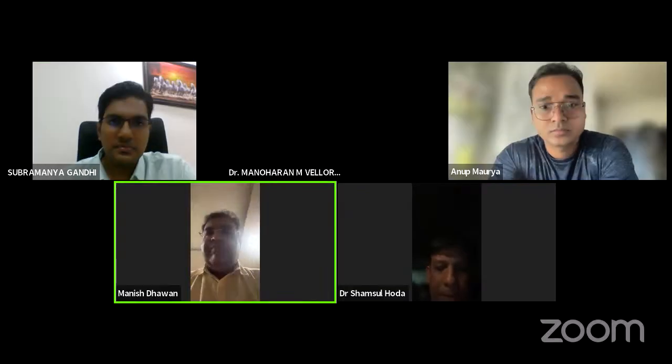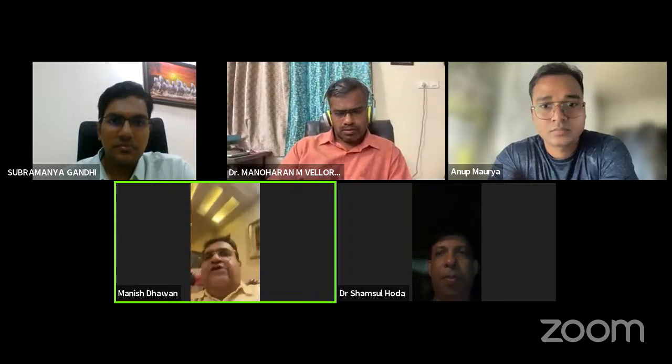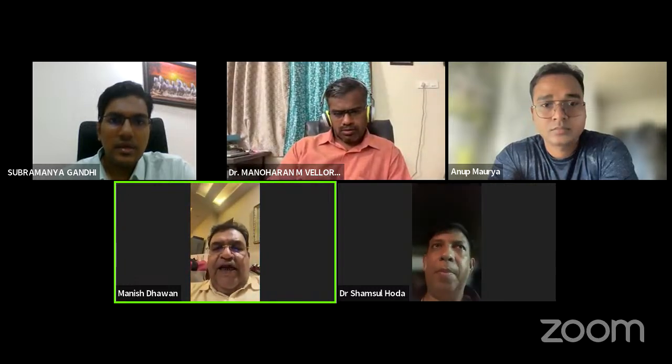So you had given a comment that more wires should be used in metaphyses and fewer wires in diaphyses. Yes, sir. Hybrid fixation in diaphyses and try to go for pure wire fixation in the metaphyseal and epiphyseal area, sir. That is, use wire and Schanz pin in the diaphyseal area.